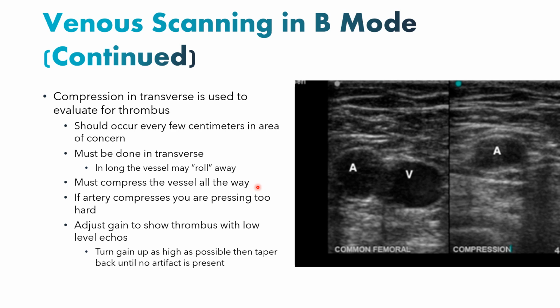The early acute thrombi can be very hypoechoic, and so even if you get most collapse of the vein, but not complete collapse, it could indicate that there is a thrombus there, and you'd want to evaluate that more carefully with color, looking for any disruption of the flow against that venous wall.